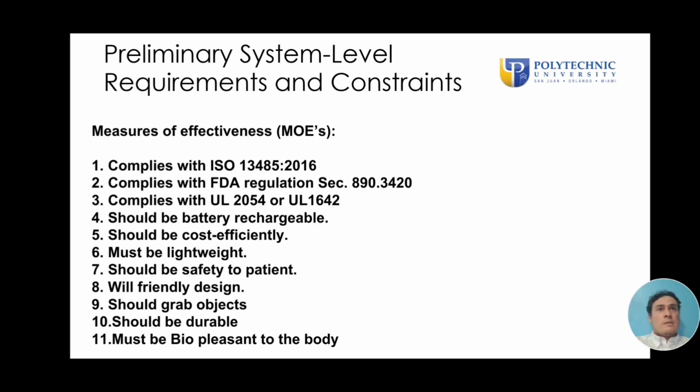We have other MOEs: it should be battery rechargeable, should be cost efficient, must be lightweight, should be safe to the patient, have a user-friendly design, should grab objects, should be durable, and must be biopleasant to the body.